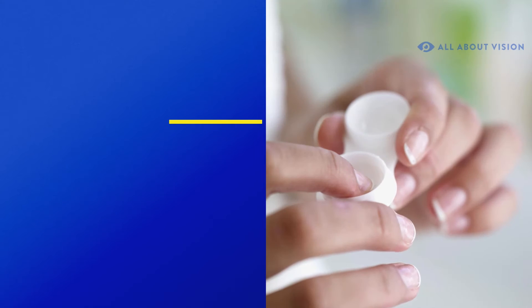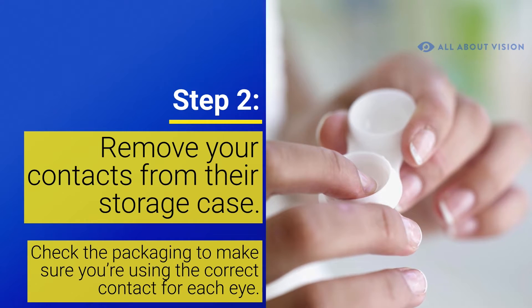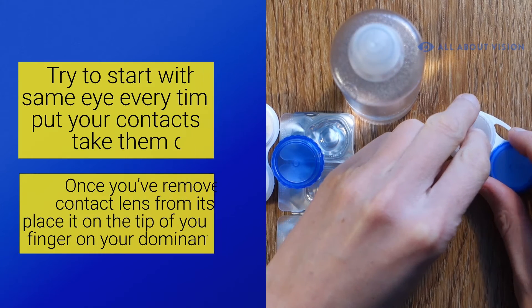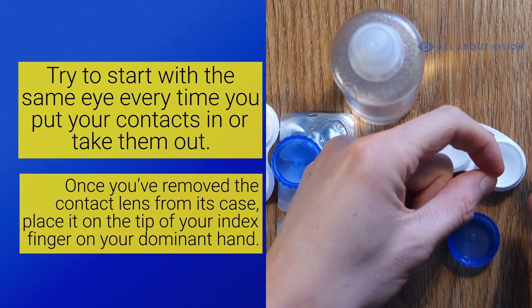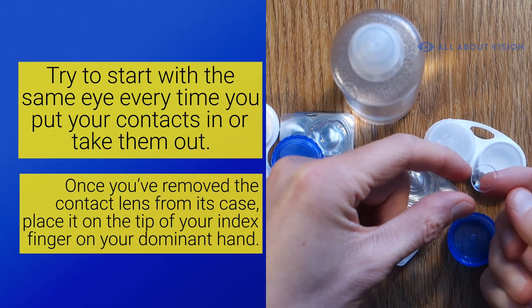Step 2. Remove your contact lenses from their storage case. If you have different prescriptions in each eye, check the packaging to make sure you're using the correct contact. Try to start with the same eye every time you put in your contacts and take them out. This way, you can't get the lenses confused with each other. Once you've removed the contact lens from its case, place it on the tip of your index finger on your dominant hand.